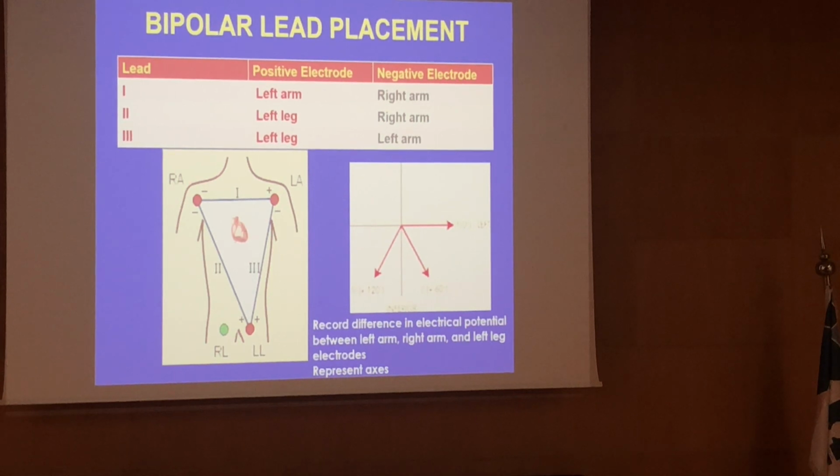This is standard, you know. So always when we place an ECG, we put the negative electrode here, we put the positive electrode here, and this is lead 1. If somebody misplaces them, which is a common error in ECG, we call it limb lead reversal, and the machine will actually flag it because this is the standard. The standard way is to put the positive electrode for lead 1 here, and the positive electrode for lead 2 and lead 3 in the foot.